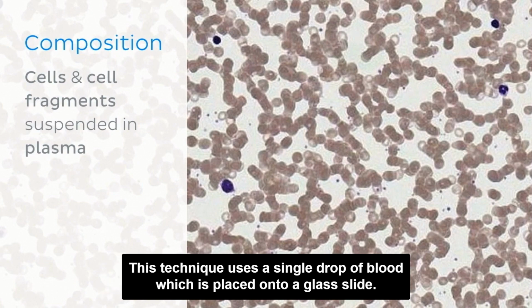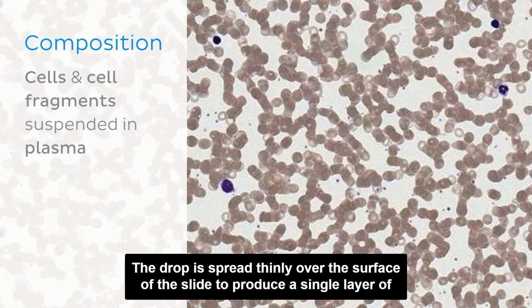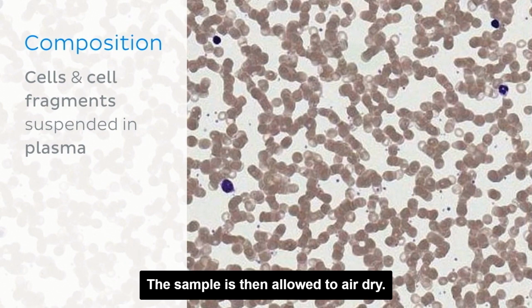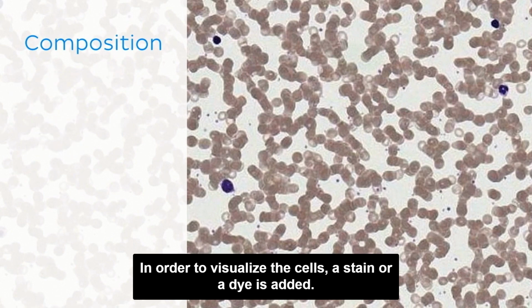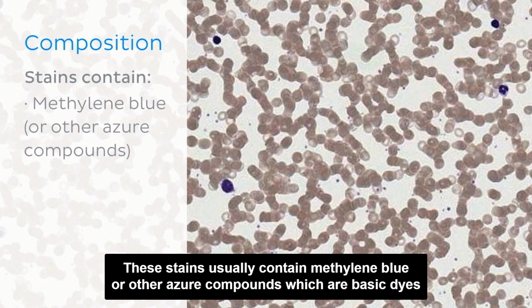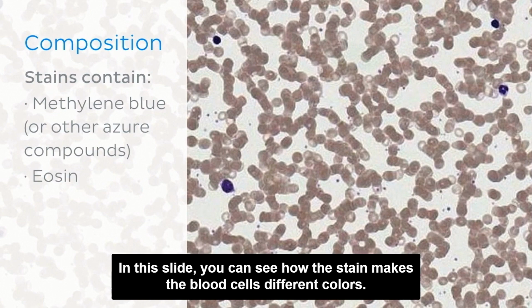This technique uses a single drop of blood which is placed onto a glass slide. The drop is spread thinly over the surface of the slide to produce a single layer of cells. The sample is then allowed to air dry. In order to visualize the cells, a stain or a dye is added. These stains usually contain methylene blue or other azure compounds, which are basic dyes, and eosin, which is an acidic dye. In this slide, you can see how the stain makes the blood cells different colors.